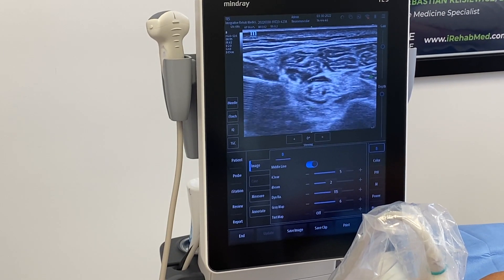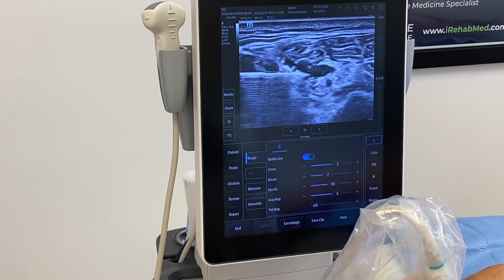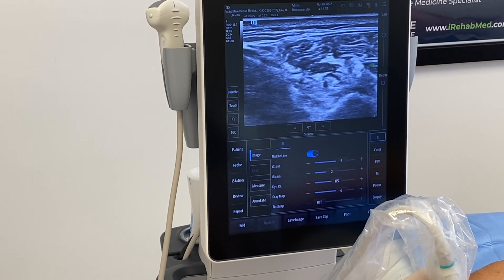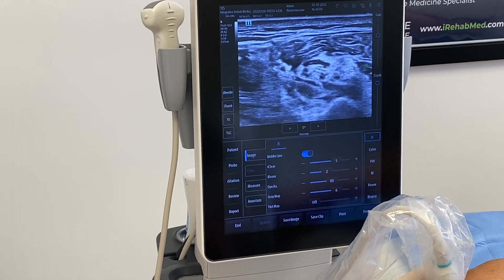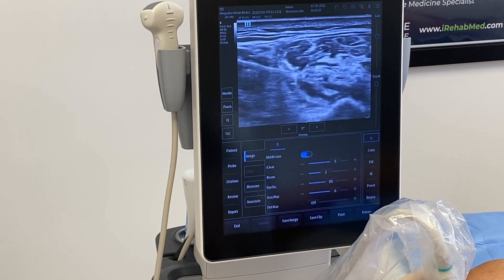Here's my needle, and here's my needle above the nerve. I'm going to put some PRP right above it, and I'm going to go underneath it as well. The nerve is being released. I'm going to go above it one more time.